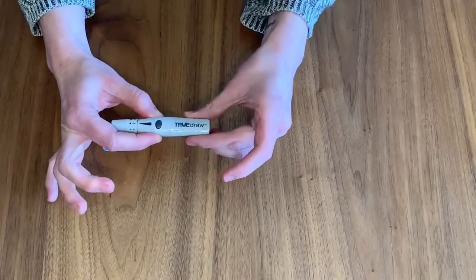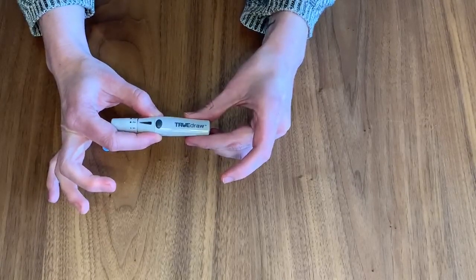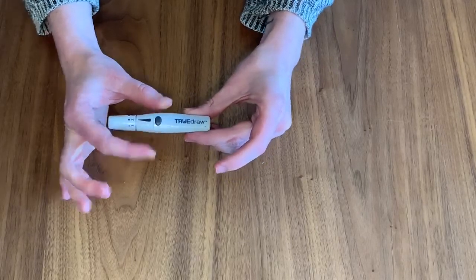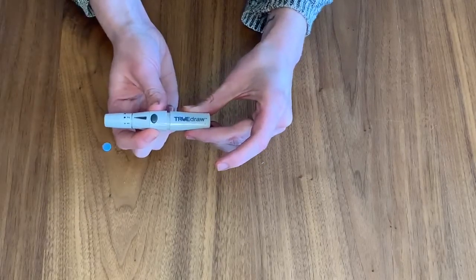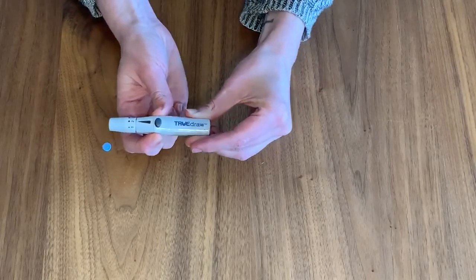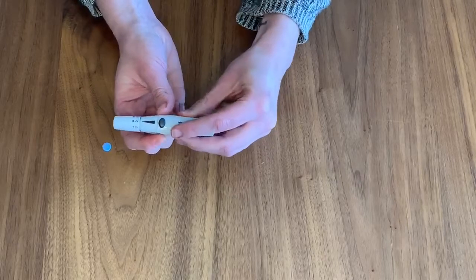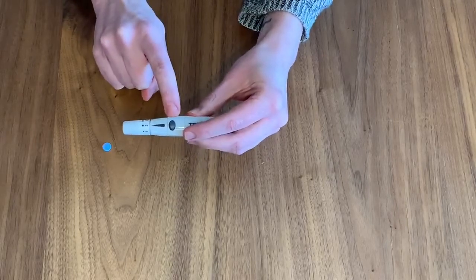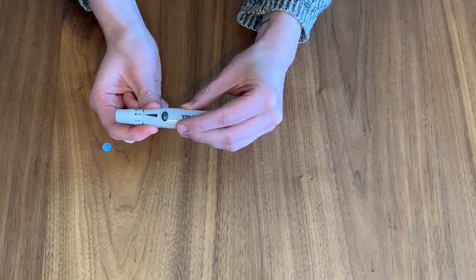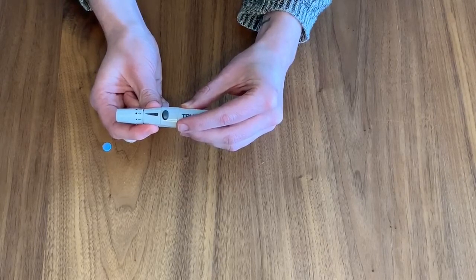To activate your lancing device, because it is spring-loaded, you will need to either slide or pull back on something to activate the spring. For this lancing device, hold it in the middle with one hand and slowly pull back on the other end with your other hand. You will feel or hear a click, and the button you need to press will pop up. If you can't press the button down, you have not pulled back far enough to activate the spring.